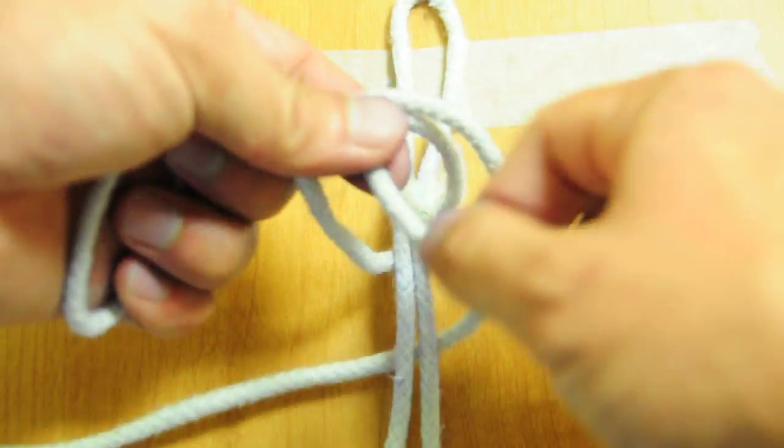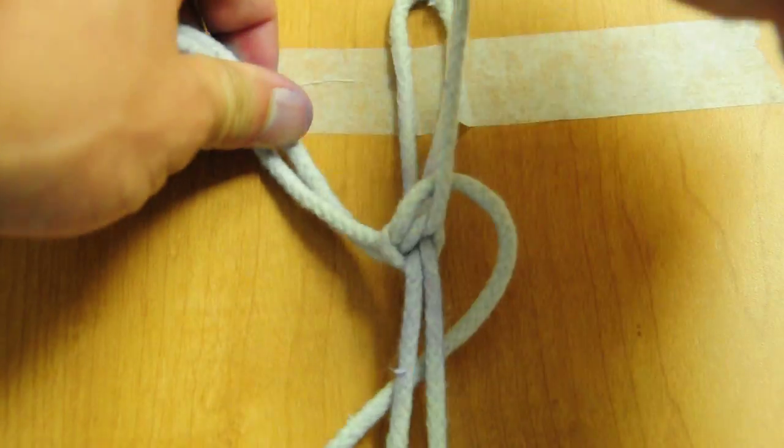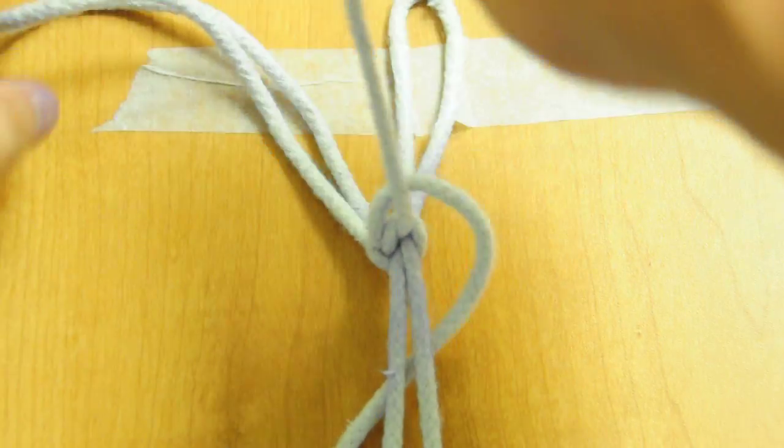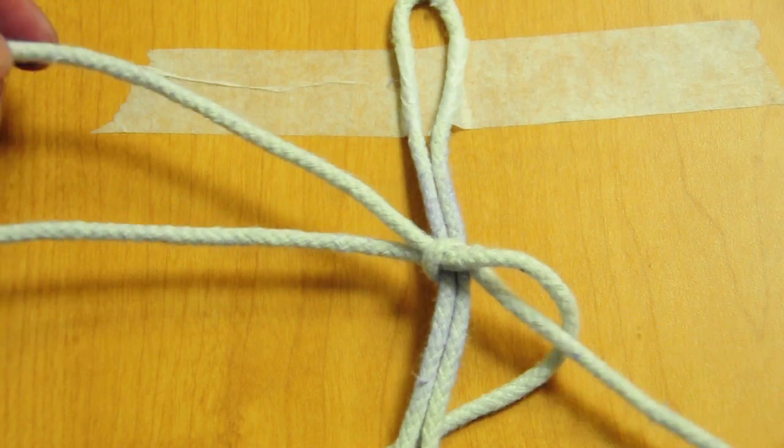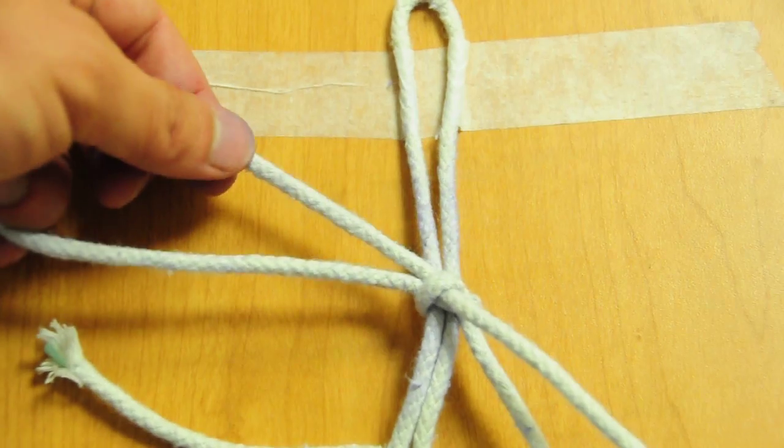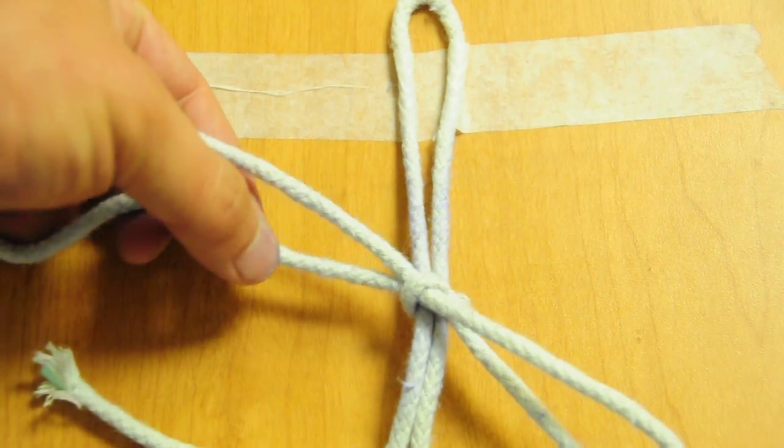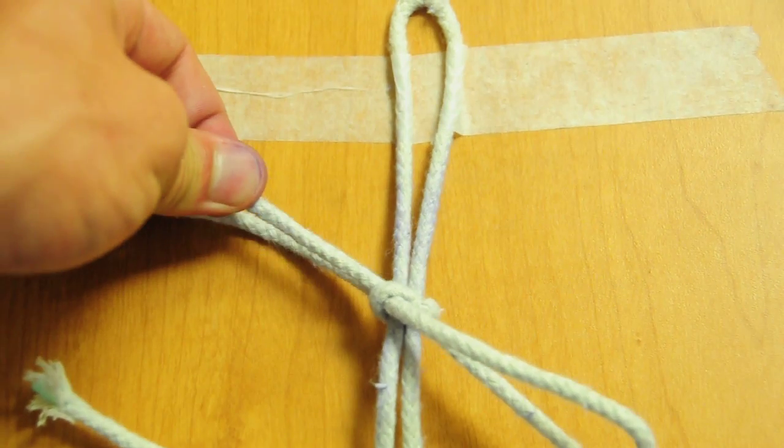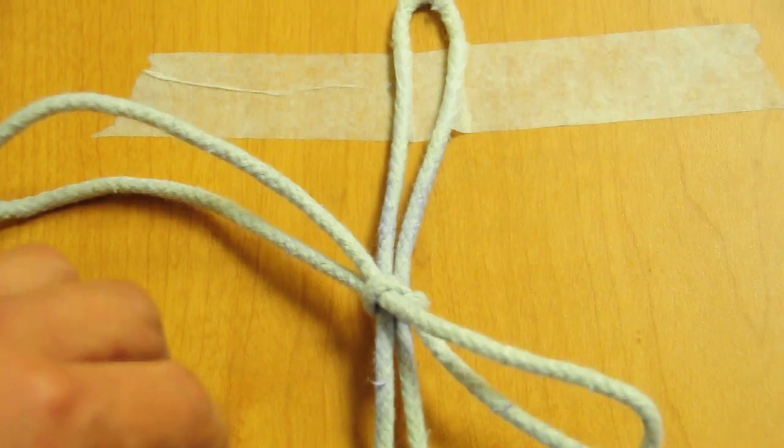The third thing, which is important to remember, again, one strand under the knot, is you've got to cinch down on both ends. So in this case, you'd be cinching down here, and cinching down here. You've got to cinch down both sides to find out where the actual knot is.